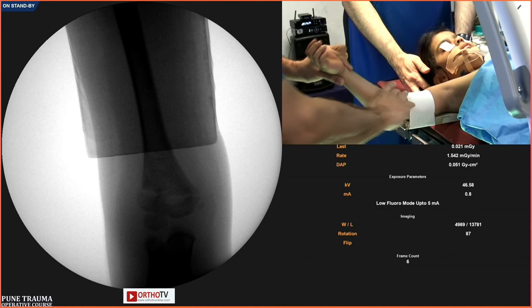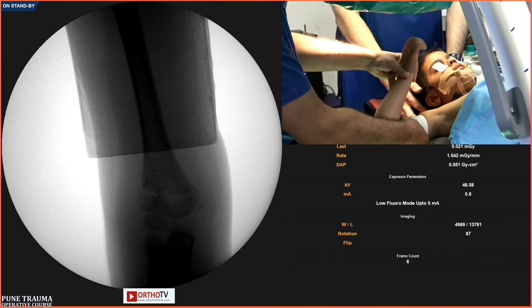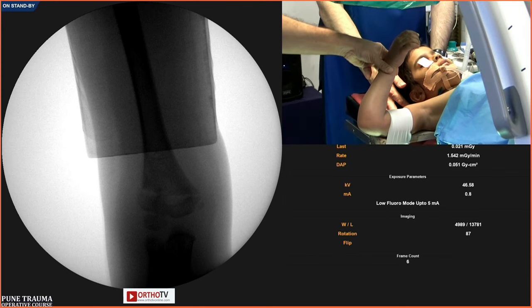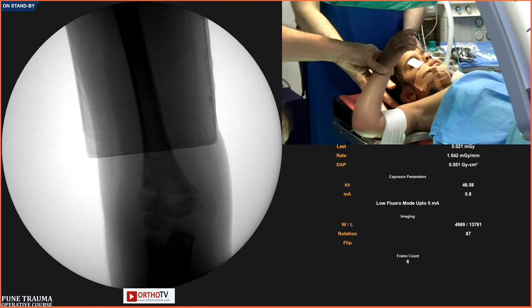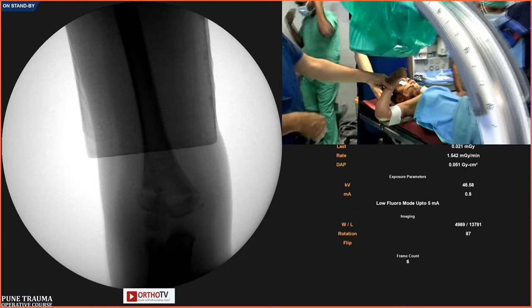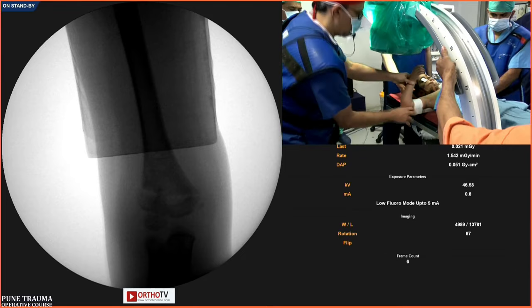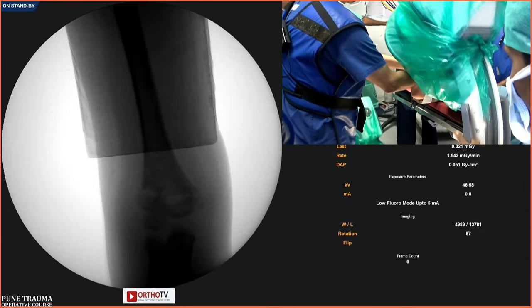Okay. Now with this, I will acutely flex it. Now I don't need to rotate the arm for a lateral, I'll rotate the C arm. Put the table over. Any questions from the audience? Feel free to ask. The table going up and the C arm being rotated.